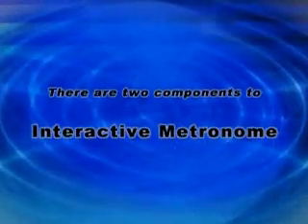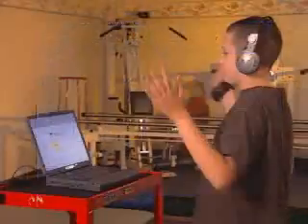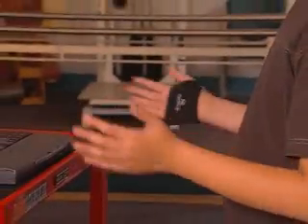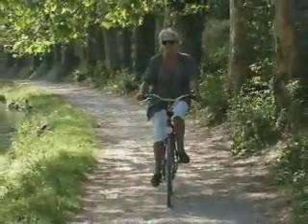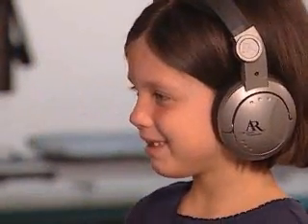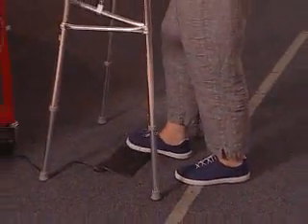Interactive Metronome can be used in two ways. The first is as an assessment tool. The patient wears headphones and uses an IM glove with palm trigger or a floor sensor to perform the IM exercises. These exercises are designed to objectively measure and strengthen motor planning, sequencing, and rhythmicity. The patient hears a steady, rhythmic beat through the headphones and attempts to synchronize an exercise such as clapping or tapping their foot to the beat.